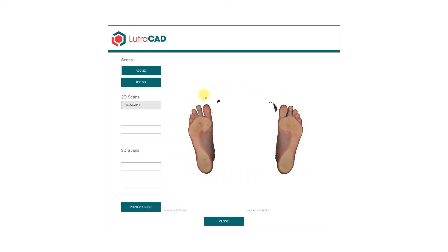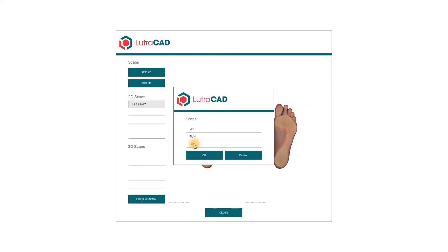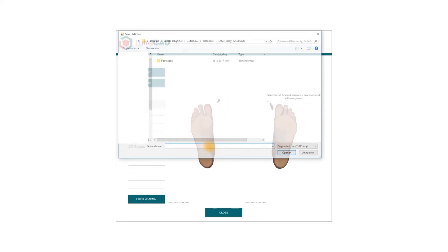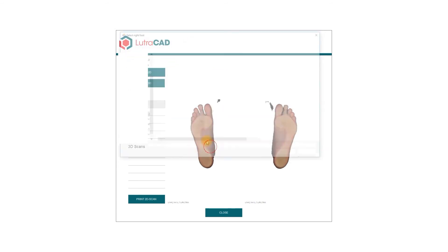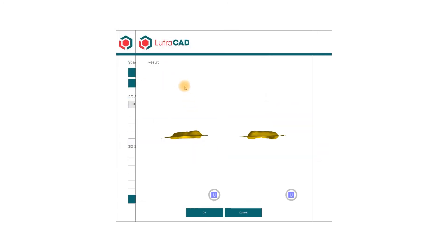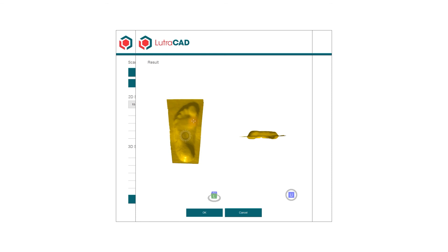For adding 3D scans, we can do the same. Click on Add 3D, choose which feet you want to add, and locate your files. A preview will be shown.